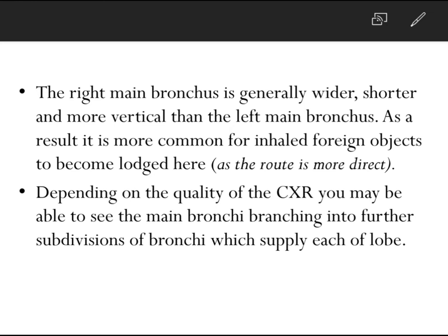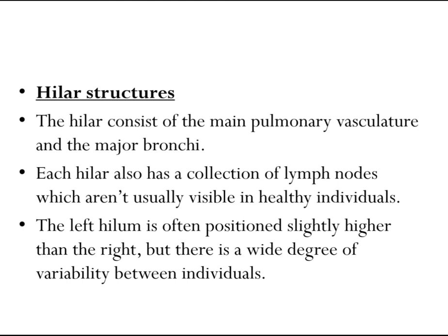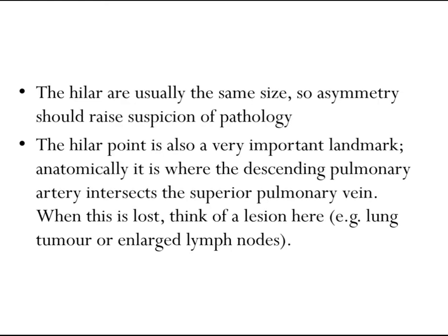As a result, it is more common for inhaled foreign objects to become lodged in the right main bronchus as the route is more direct. Depending on the quality of the chest x-ray, you may be able to see the main bronchi branching into further subdivisions supplying each lobe. The hila consists of the main pulmonary vasculature and the major bronchi. Each hilum also has a collection of lymph nodes, which aren't usually visible in healthy individuals. The left hilum is often positioned slightly higher than the right, but there is wide variability between individuals.